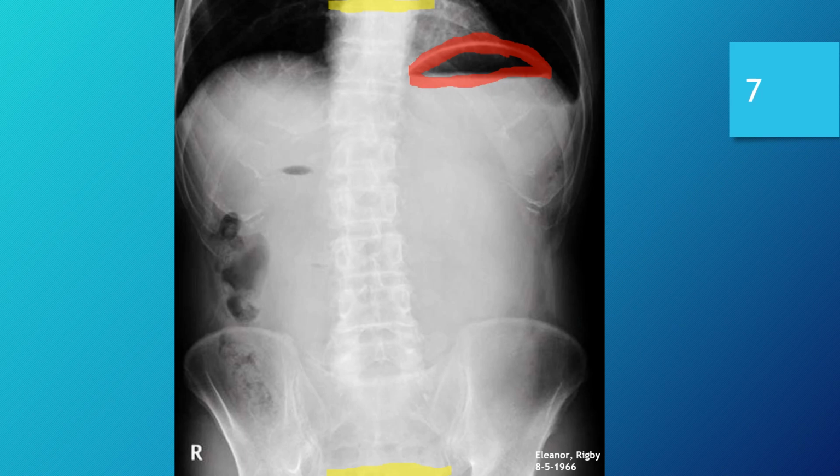And one of those is the presence of the patient's diaphragm. It's fully visible on this image, with the exception of a tiny area on the lateral aspect of the right side there. Just a tiny bit of the diaphragm that's not present. And then as far as the inferior portion, this image is adequate for an upright abdomen. It does include the iliac crest very well. Actually, about the top half of the patient's pelvis and the area of the bladder is included there.